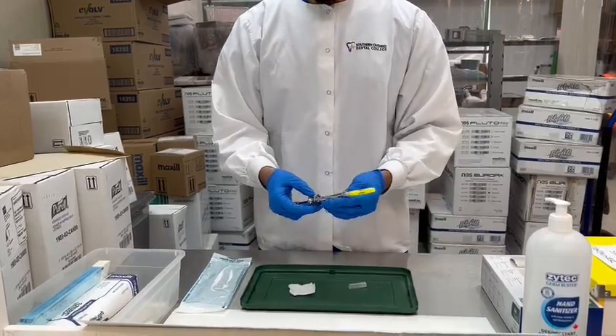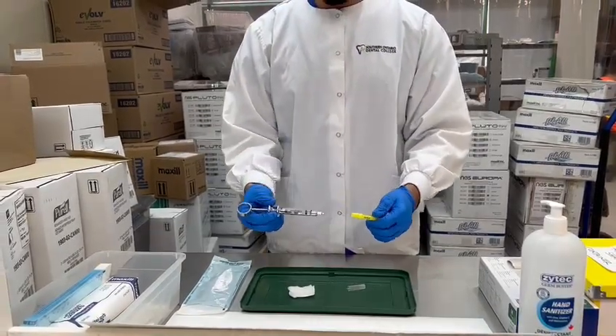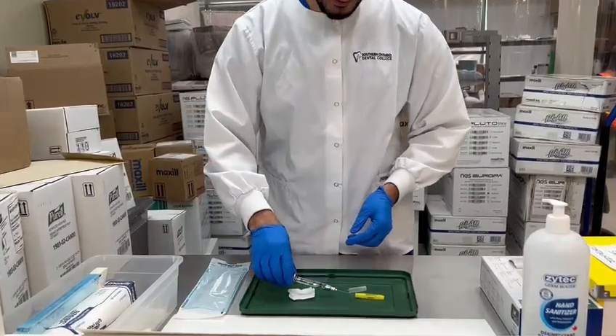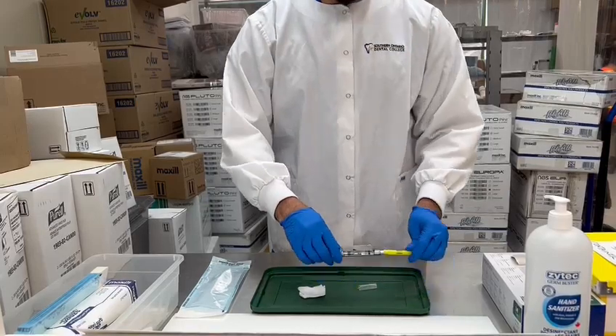We open up the needle and attach it to the syringe. Now we need to make sure that the needle is working, so you open it up and test it on the gauze. You see it dripping so it's working, and then you use the scoop method to put the cap back on the needle.